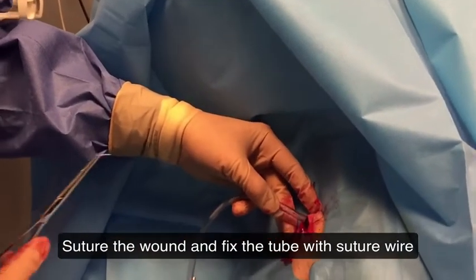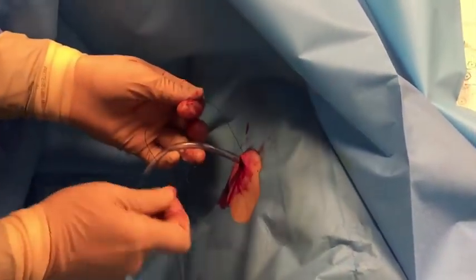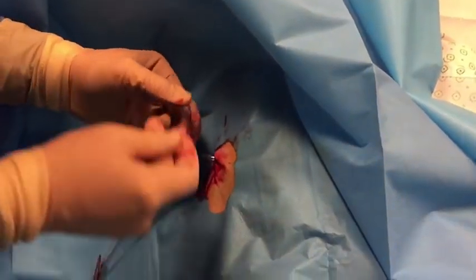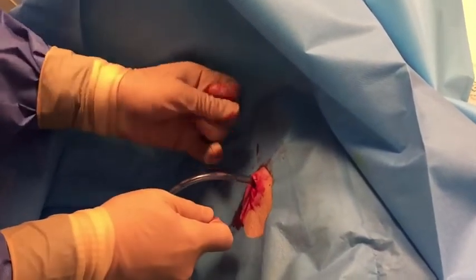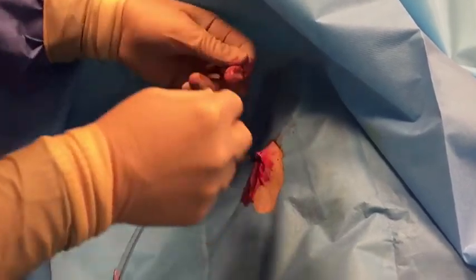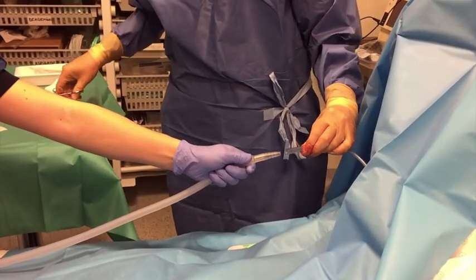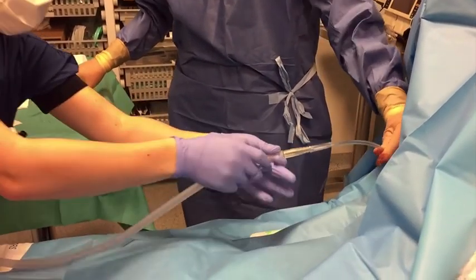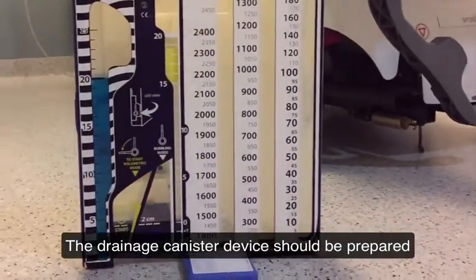Place enough sutures to prevent air suction. Use suturing wire to keep the tube in position. Keep sterility in mind when connecting the tubes, and beware to fill the drainage canister device beforehand.